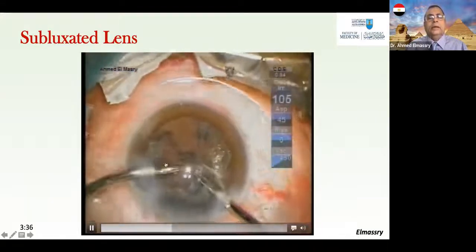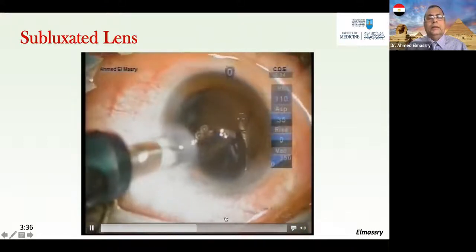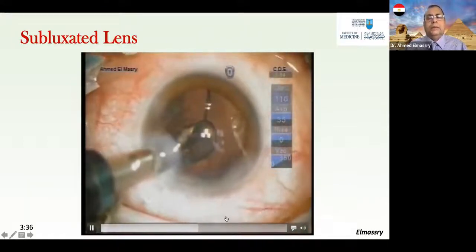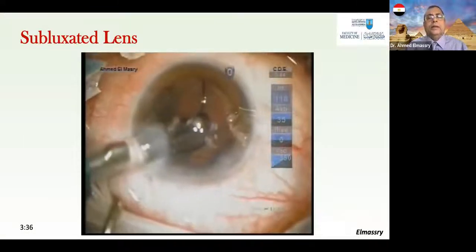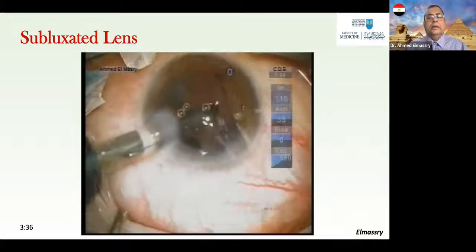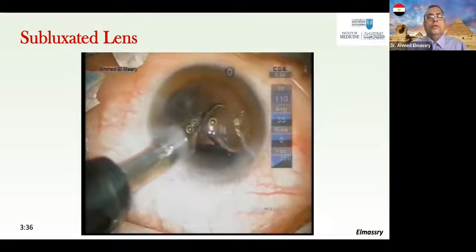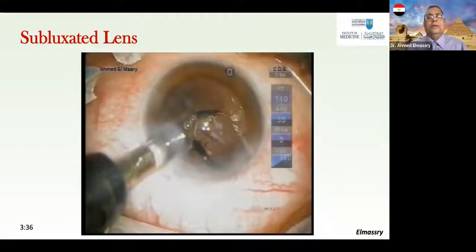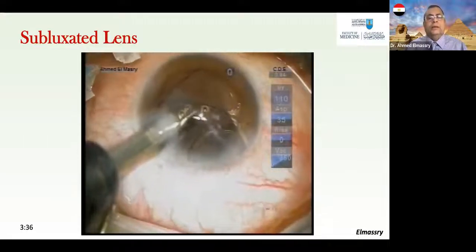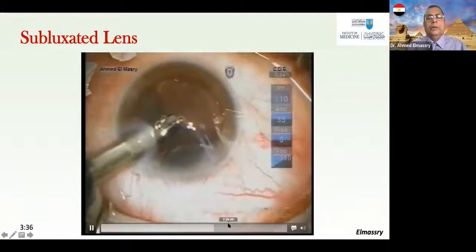But in spite of that, some areas could be dehiscent and vitrectomy is needed in these cases. After implantation of the 3-piece IOL, don't forget that these rings give you support, so that you can even put your IOL over the rings with a defect in the posterior capsule. This is one of the advantages of these rings, but sometimes it may need suturing to centralize the IOL.